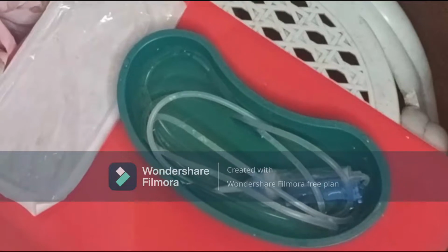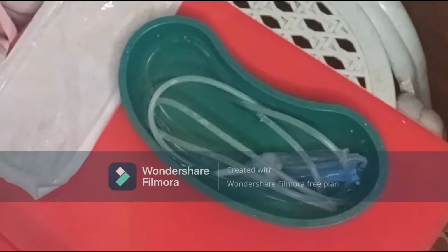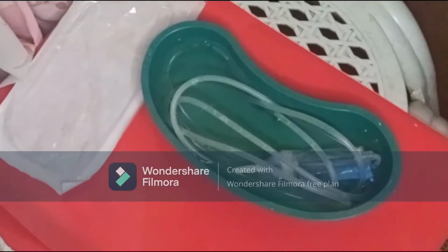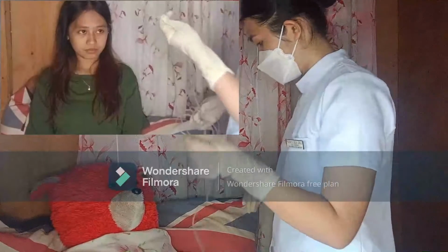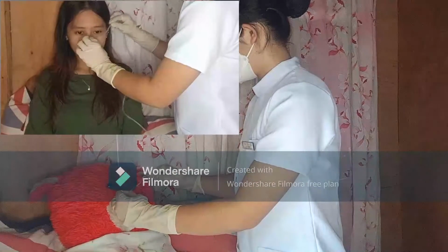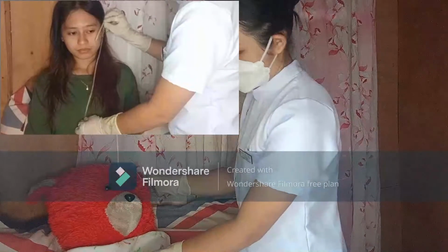Prepare the tube. If a small bore tube is being used, ensure that the stylet or the guide wire is secured in position. If a large bore tube is being used, place the tube in a basin of warm water while preparing the client. Then, determine how far to insert the tube. Use the tube to mark off the distance from the tip of the client's nose to the tip of the earlobe and then from the tip of the earlobe to the tip of the xiphoid.